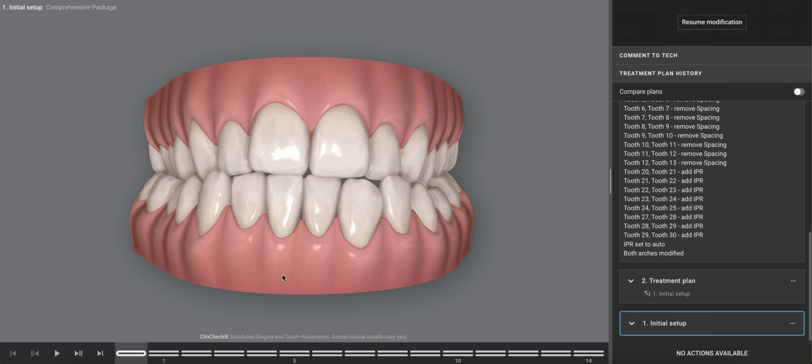The likelihood of having unintended consequences of trying to fix this without fixing the skeletal foundation, those risks might be higher than normal. With that said, can we create a plan that's lower risk, but then build the patient's understanding into the treatment plan, meaning educate them on why this is difficult?